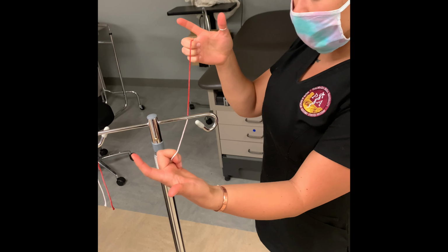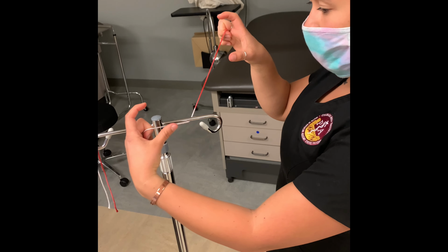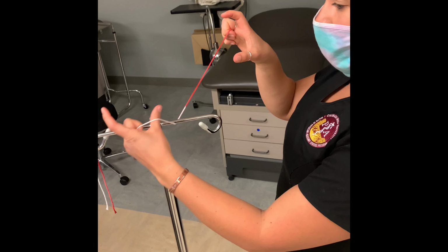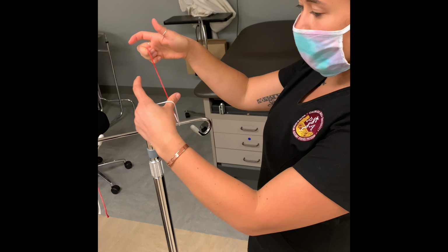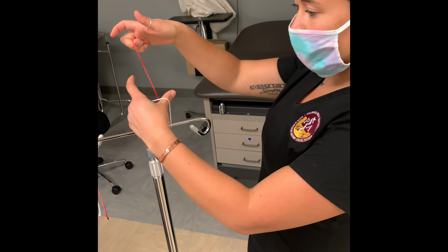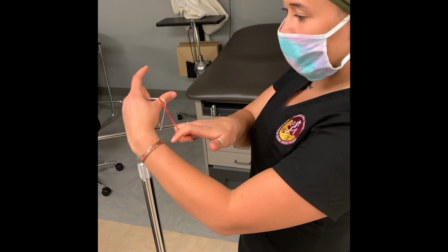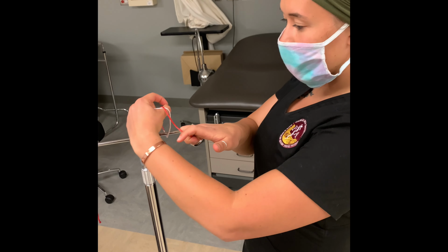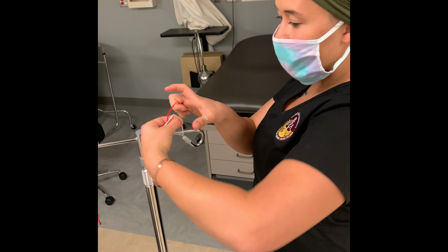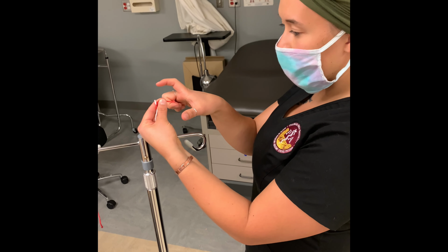Make a C with your left thumb and index finger. Loop left thumb under the left string and lead it to midline with your thumb. With your right hand, feed the strand into the C created with your left hand. Pinch left thumb and index finger together to close the C. Pivot left wrist downward and through the loop. Pinch the right strand with your left thumb and index finger.